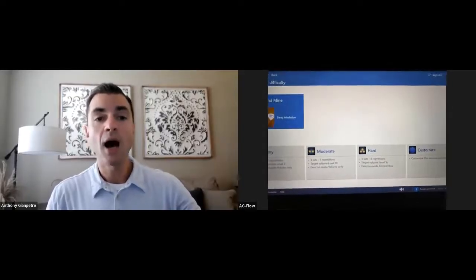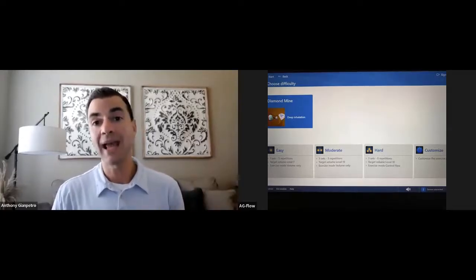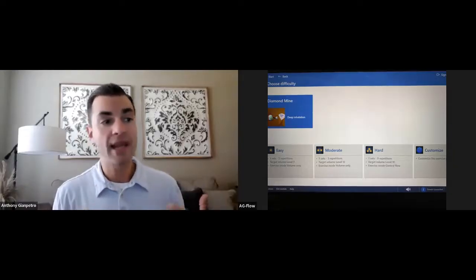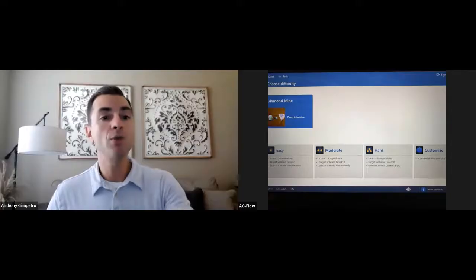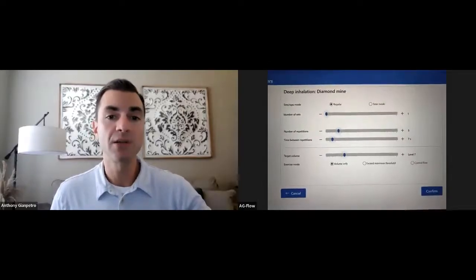Use one of those. What we would really prefer is that you do the assessment with Flow, figure out the capacity that your patient has, and then tailor it to them. So easy, moderate, hard may benefit them, but it may not. And what do I mean by that? Well, think of the overall volume that they're taking in. Level 7, level 10, level 10, like you're seeing for the easy, moderate, and hard, it may be appropriate, it may not. So what you can do is go under Customize, and that's where all the parameters can be found. And I'll zoom in on this a little bit more so it's a little clearer for you.